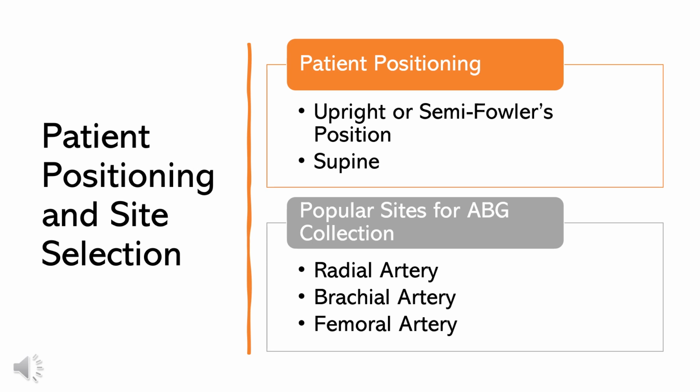Be knowledgeable of the anatomical risks, as it's near nerves and large blood vessels. We also might use a femoral artery. In critical cases, be prepared for femoral artery access. This site has high complication risks. That's why your adept assistance and keen observation is needed.